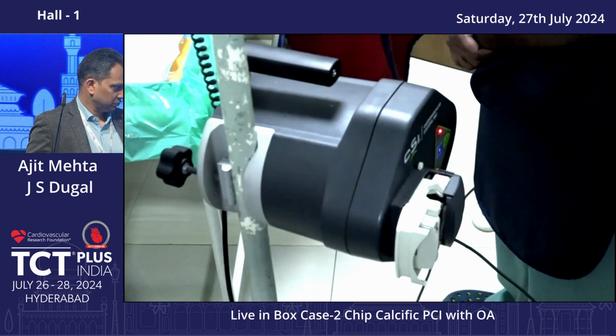Just one thing to clarify: for an osteal lesion, that makes sense if you're going to do it in reverse. But if it's very tight, you definitely do not want to use orbital atherectomy in a tight osteal lesion, because you're not coaxial and it orbits and you can dissect the aorta that way. So you have to have enough of a channel to get it forward through with the glide assist to make it safe in an osteal lesion. The only reason I want to interrupt is that I don't want anybody to take away from this that it's the device of choice for a tight osteal lesion, because it absolutely is not.